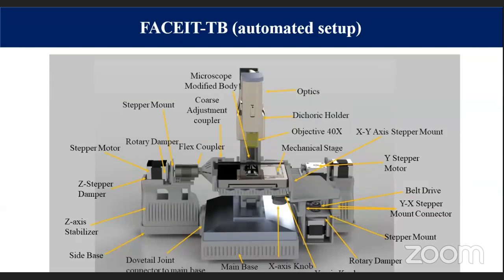As soon as the imaging device observes the image, it sends it to the central server, where the image processing is done. So this system becomes very light. It can be deployed in any rural place, and it can communicate easily with the central server.